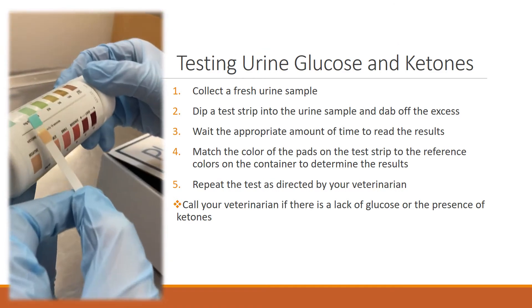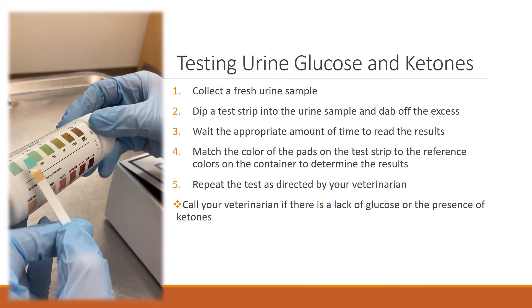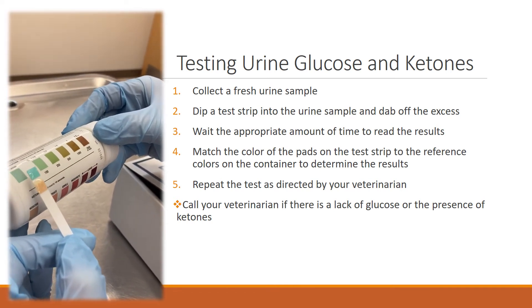As we can see here, this one is negative for ketones, and I would also say that this is negative for glucose.